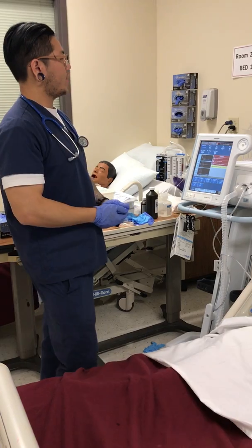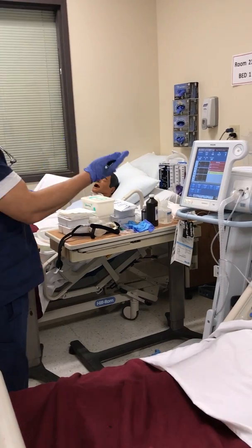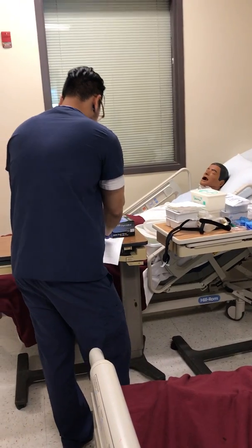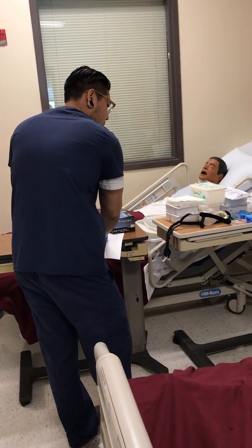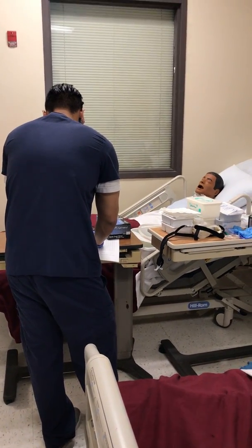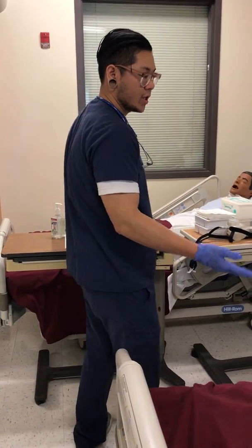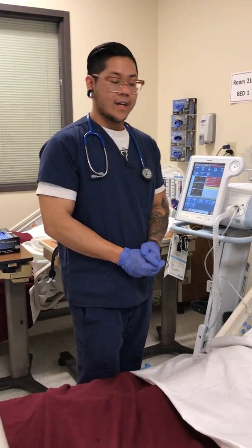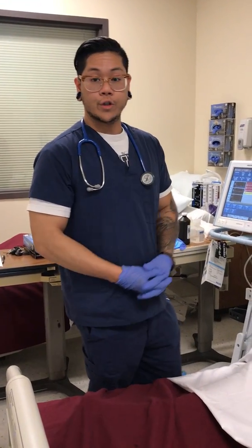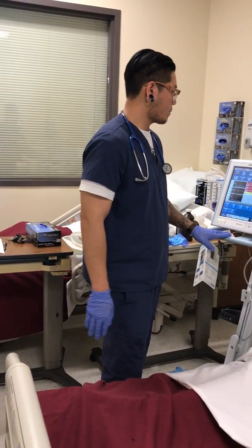And then don't forget to chart. You can have your flow sheet, and you want to chart whatever settings you put on there, your settings and your alarms. Okay. Check their saturation levels. Make sure the patient is feeling comfy. And then let him know that if there's anything he needs, he can call for the nurse, and they can come. Now that it is set up, you want to double check and make sure everything's okay.